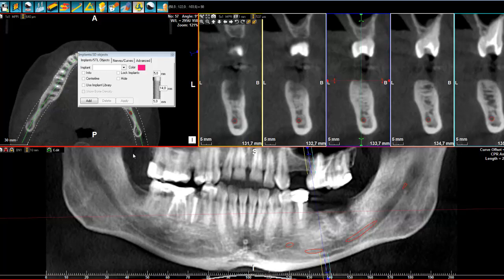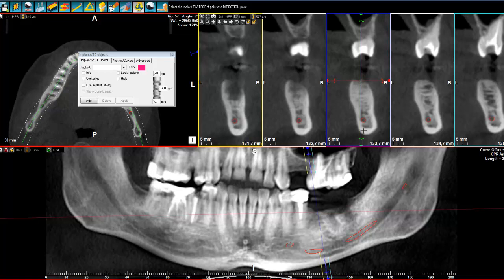Now you have two possibilities: you can add the implant directly on this view, or in any view that you want. The good news is that whatever we do, we can change it afterwards. Let's click on Add. The first thing we need to click on is the crest. I was about to place it here, but I changed my mind and will place it here, because then I have a better visualization of the mandibular canal. First click should be on the crest.